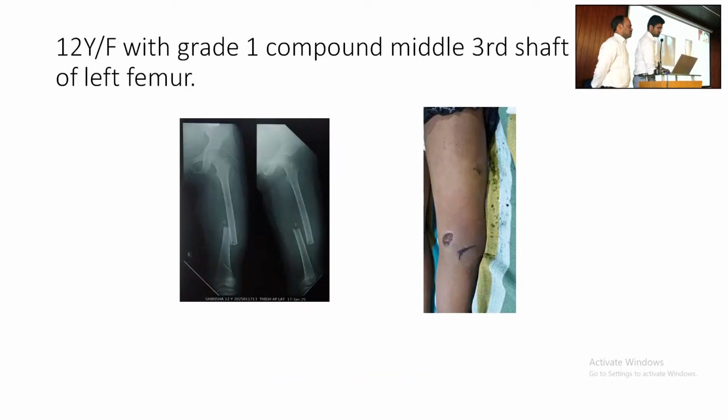There is a problem with digital X-rays. It can be zoomed or minimized. It should be at the natural size of the femur. Then only can you have an accurate assessment. That is the problem with digital. Conventional is better than this, especially when you are measuring.